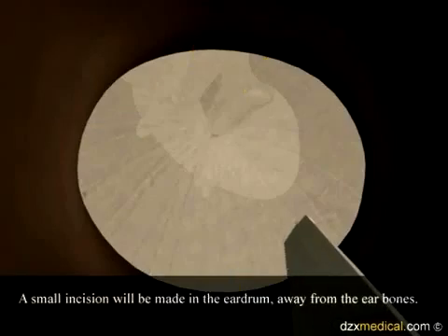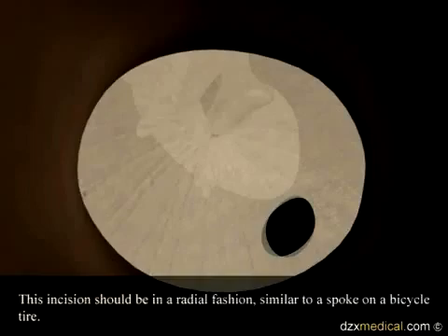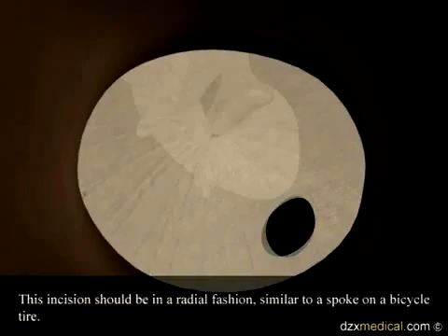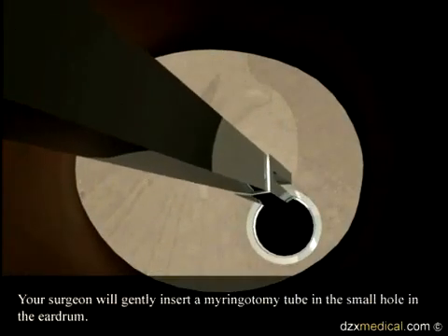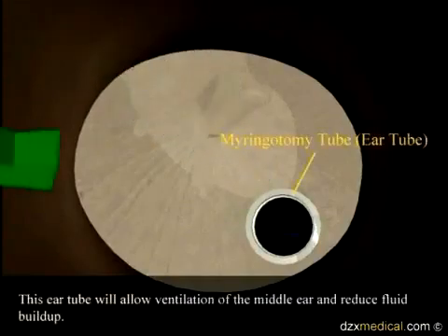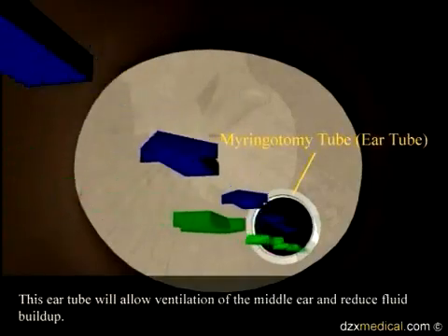A small incision will be made in the eardrum away from the ear bones. This incision should be in a radial fashion, similar to a spoke on a bicycle tire. Your surgeon will gently insert a myringotomy tube in the small hole in the eardrum. This ear tube will allow ventilation of the middle ear and reduce fluid buildup.